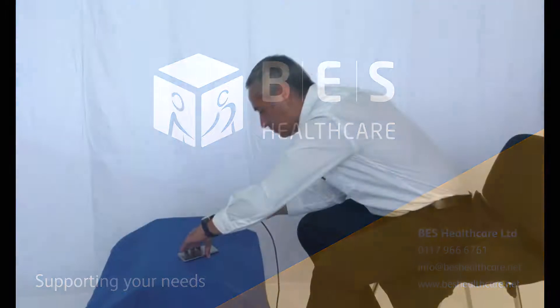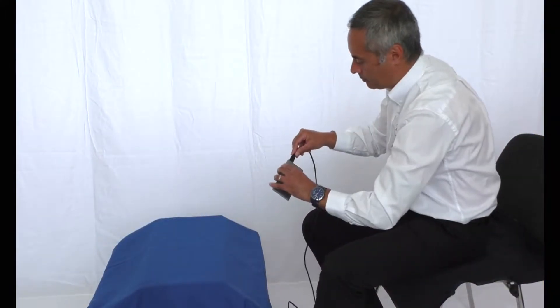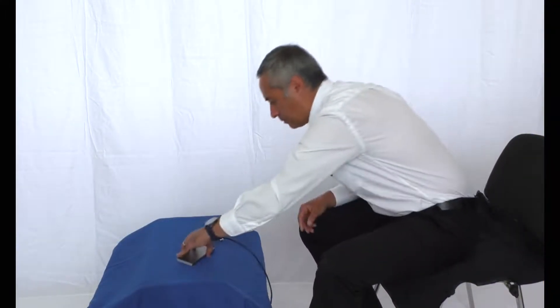The new BodyTrack map can now be connected wirelessly, so if you're pressure mapping someone with complex needs, you can still assess them from a distance.